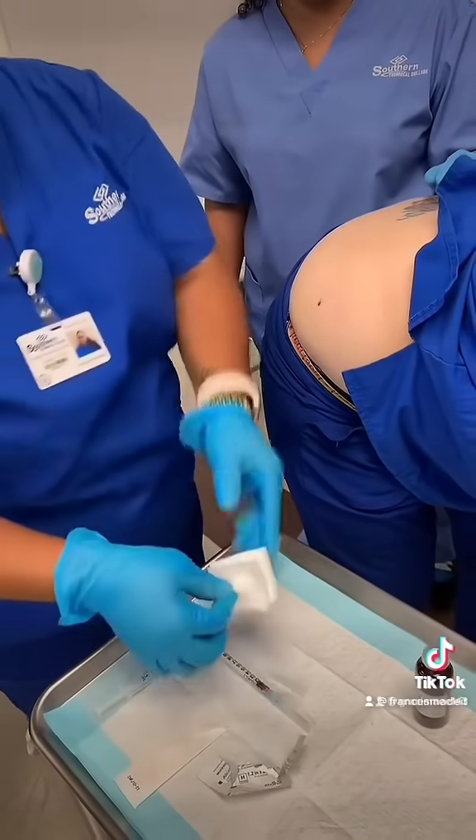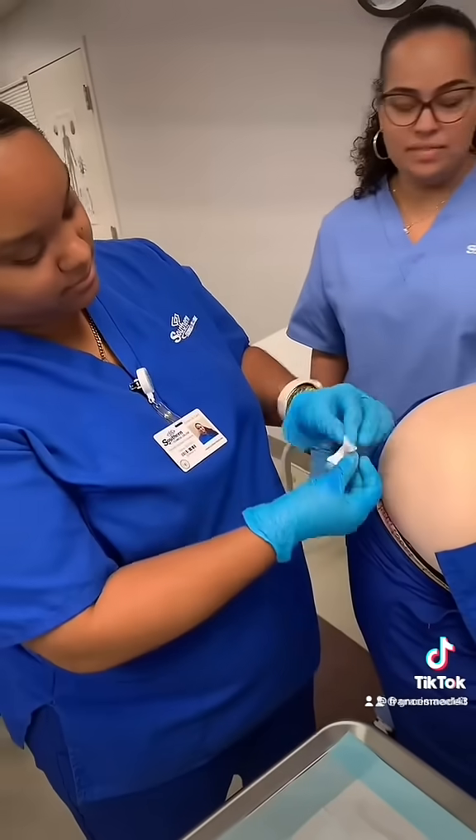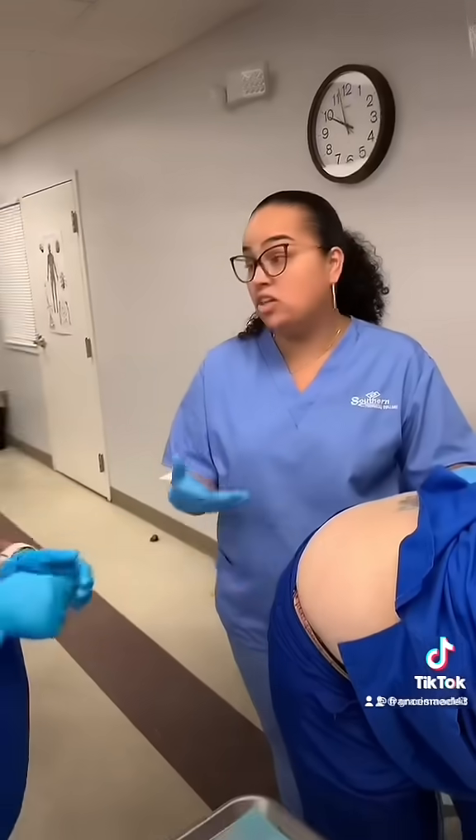You can use gauze to dry it all up. Then you ask the patient how they're doing — did you feel anything? If the patient didn't feel anything, you were successful in your injection. They should only feel the prick; they shouldn't feel pain or discomfort.